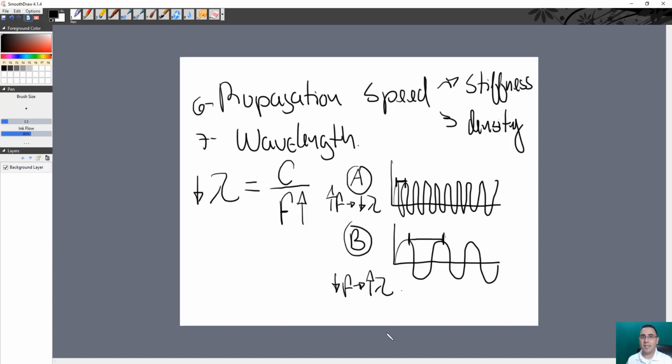I think our next tab is talking about the parameters, but for the pulse wave. Let's move to the pulse wave now.